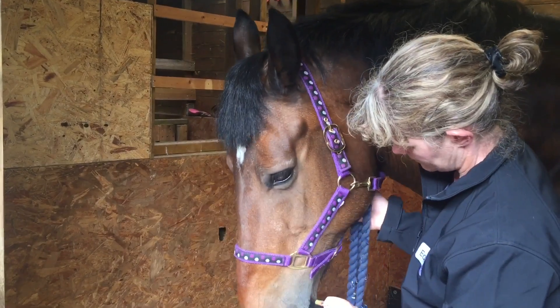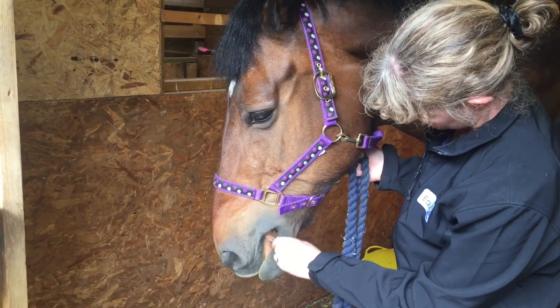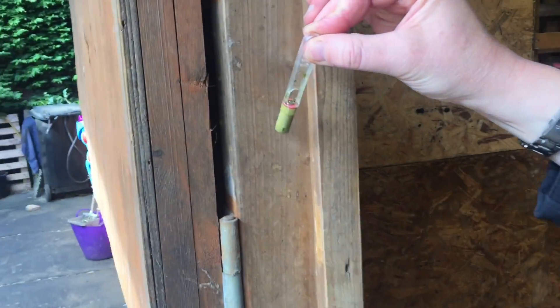It may take as long as 5 or more minutes to collect a saliva sample from a horse with a very dry mouth, but it is important to persevere until the indicator has fully turned pink so there is enough sample to test.